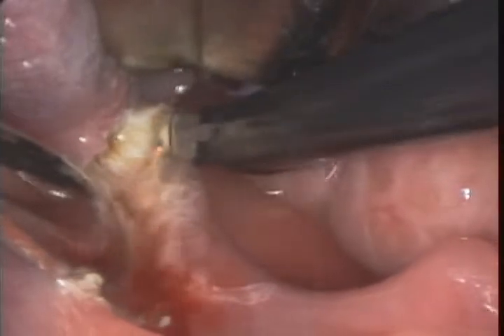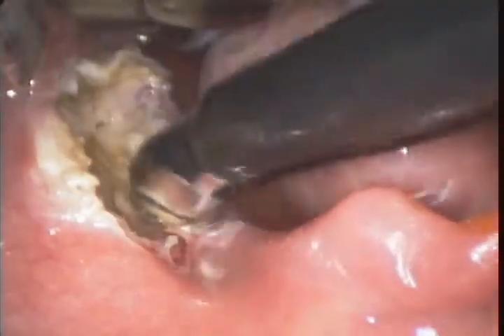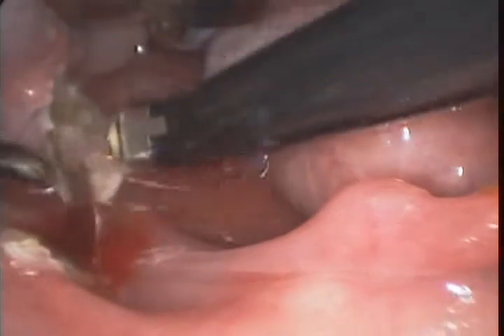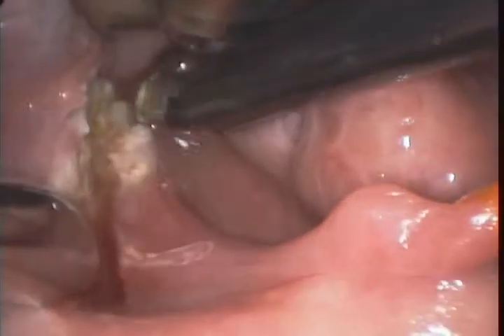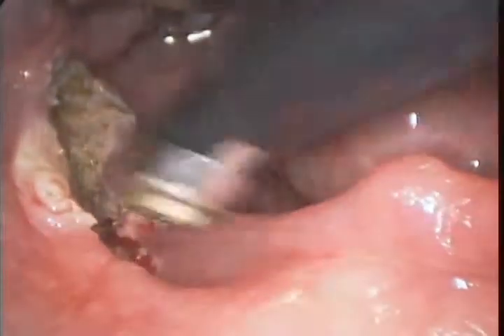This Heard retractor can be used to move the tonsil around so that you achieve a more efficient interface between the tip of the device and the tissue that you're trying to remove. You can see that this coblation handpiece is actually quite efficient at ablating the tissue in a very speedy fashion. As water accumulates in the back of the throat, you can suction it up, and that also helps prevent clogging.